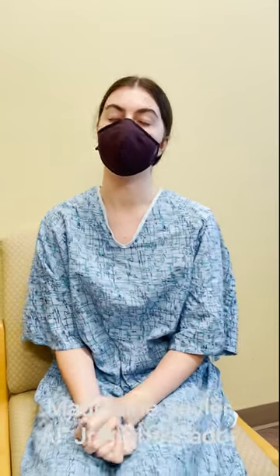This is Maddie Seiler, who is one of our Juvenile Arthritis Foundation Ambassadors. Maddie, what are you getting done today? I am doing an MRI for my wrist. And why are we doing this? We're doing this because I have arthritis in my left wrist and we're trying to see if it's gotten better or not.